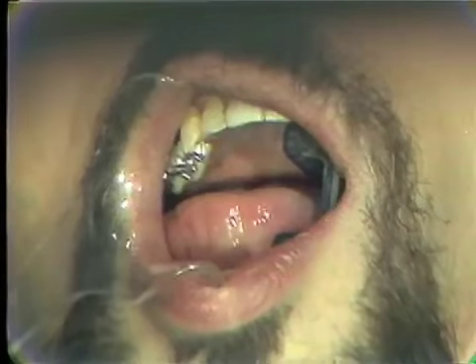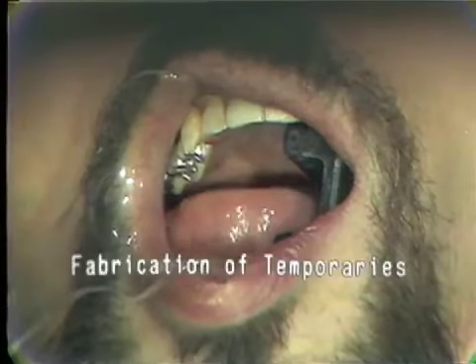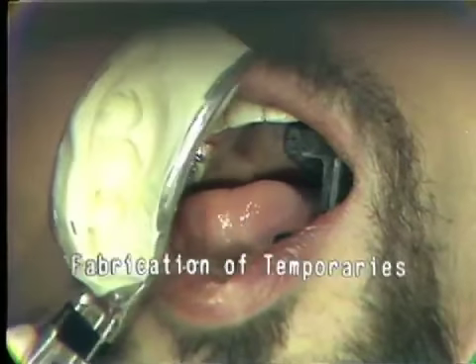Now, if we consider these objectives of temporaries, the remainder of this film will deal with the fabrication of temporaries, showing you one way that it can be done, the use of cements, and also some tissue response that we might get from temporaries. So the first thing we'd want to do is to look at the fabrication of temporary restorations. During this presentation, we will deal mainly with the formation of temporaries using an Omnivac shell.